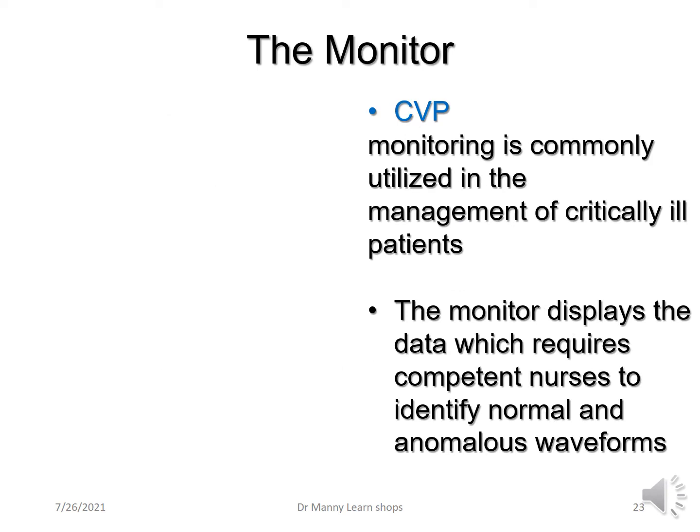Then we have the monitor. The CVP monitor is commonly used in the management of critically ill patients, and it's the monitor that displays the data, which requires competent nurses to identify normal and anomalous waveforms.